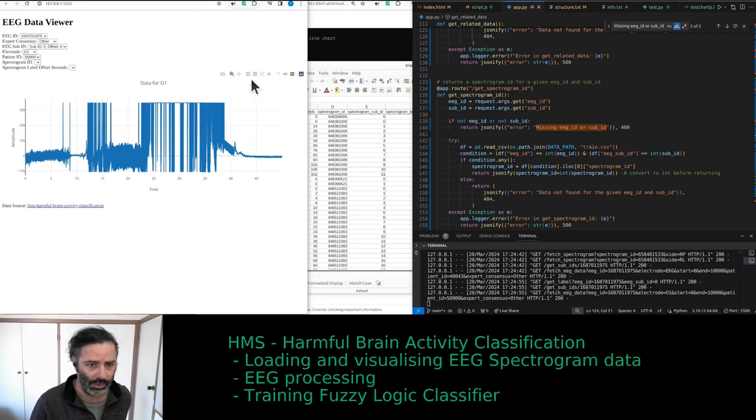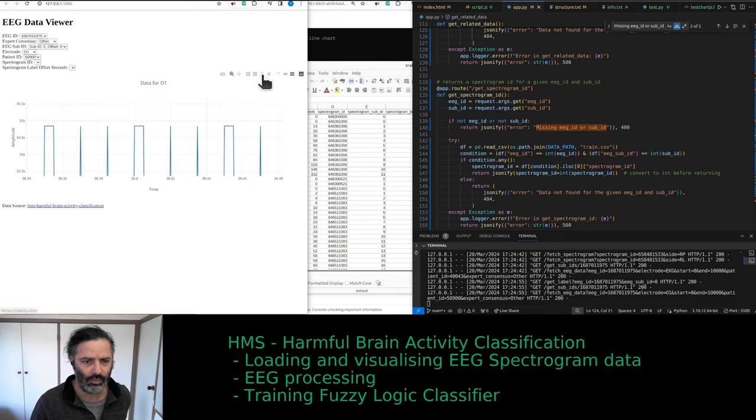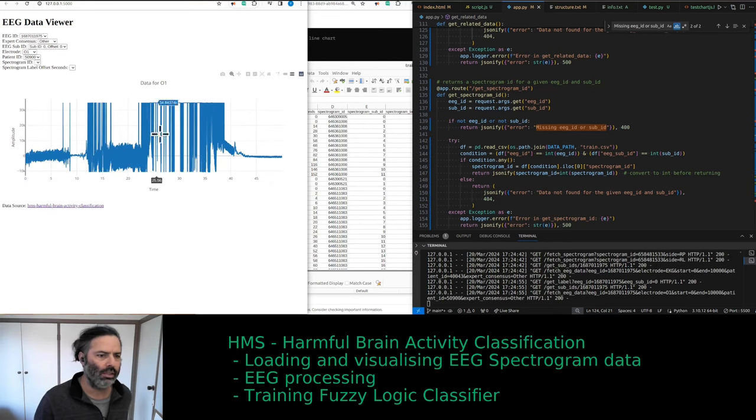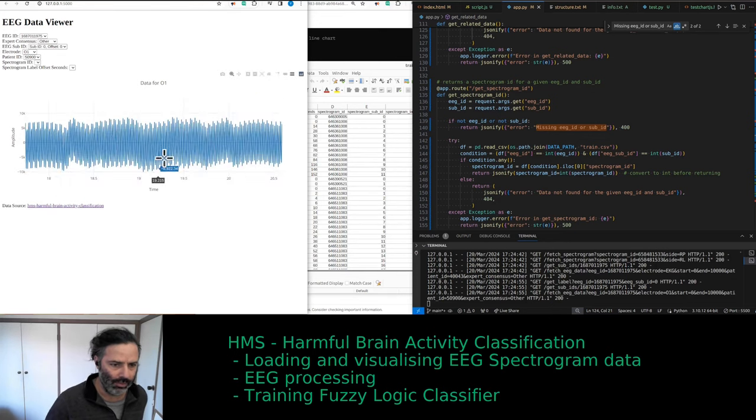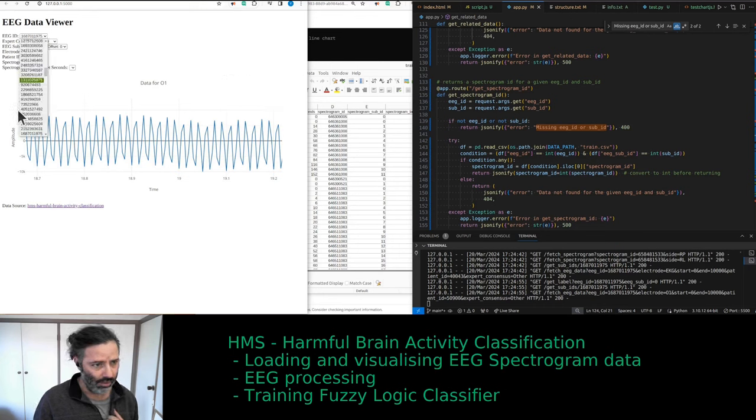Well, not wrong, you know what I mean? Bad. Why is it not here? Yeah, just clipping. This channel is clipping very badly. Some EEG there potentially, but who cares? It's probably noise, a 50 hertz or something. Something's very wrong with that electrode, so I could ignore it.